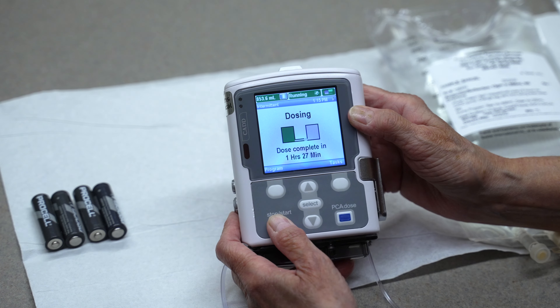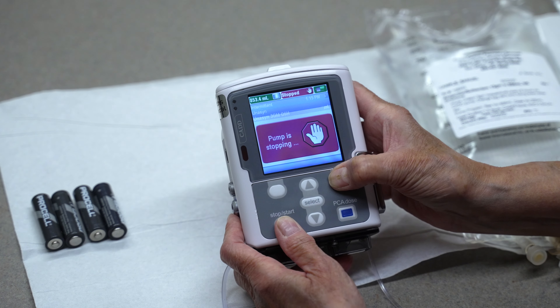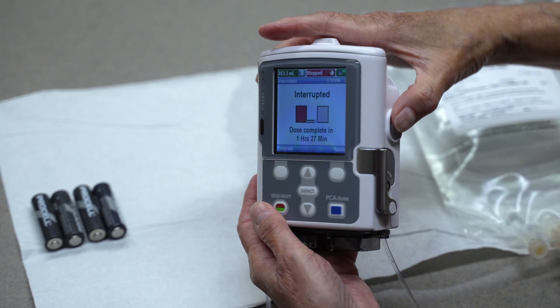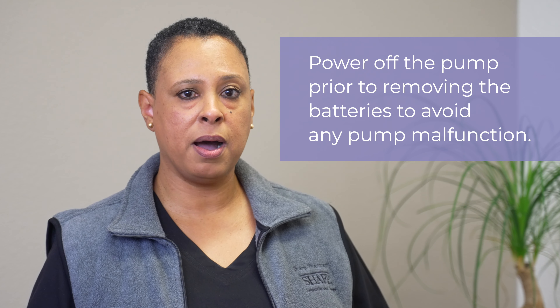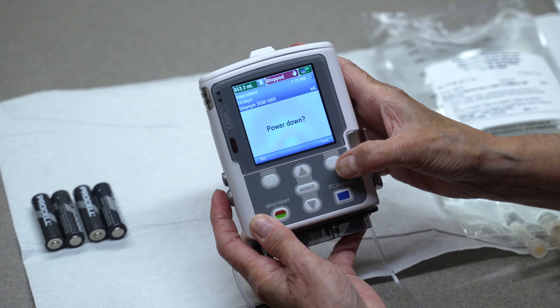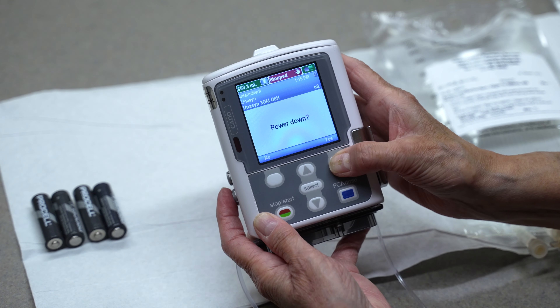Because you can only change the batteries when the pump is stopped and powered down, first press the start/stop key on the pump. When the pump screen displays "stop the pump," press the yes button. Next, turn off the pump by pressing the power button located on the right side of the pump. It is important that you power off the pump prior to removing the batteries to avoid any pump malfunction. The pump screen will display "power down." Again, press the yes button.